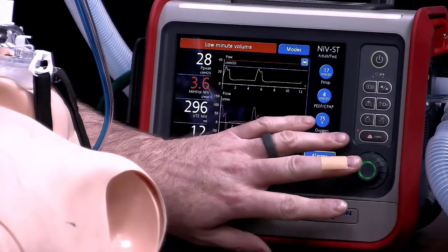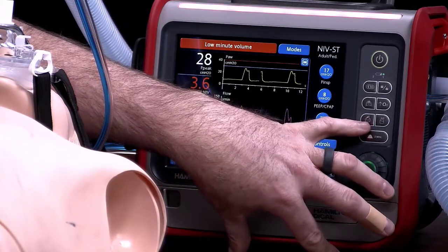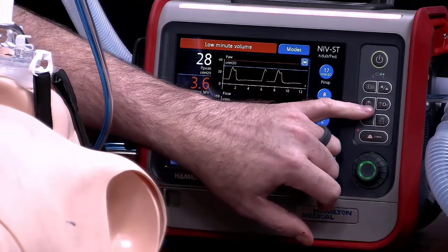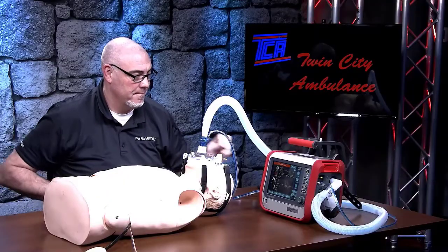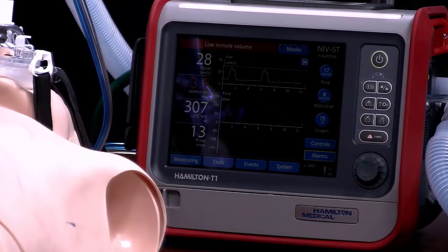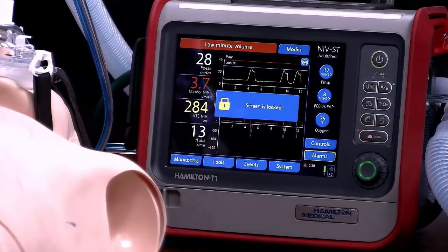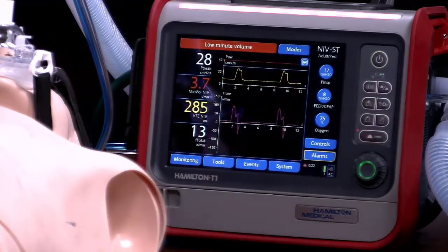A couple more things before we end: there is a control module on the side of the board with a few buttons. One button takes a screenshot of your current settings — you'll need a USB drive to get those screenshots. The button with the lungs on it is a manually triggered breath button, which you could use if you wanted to do a manual test. The light/dark button decreases or increases the luminosity on the screen for low or high light conditions. The button with the lock is a lock screen — once locked, you can't change anything by touching the screen, so you won't bump into a setting accidentally. Make sure you unlock it before you want to use the touch screen.